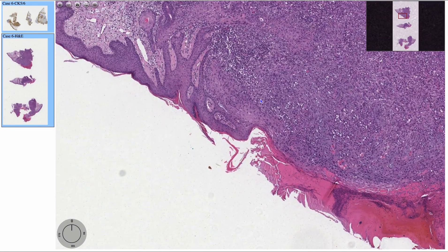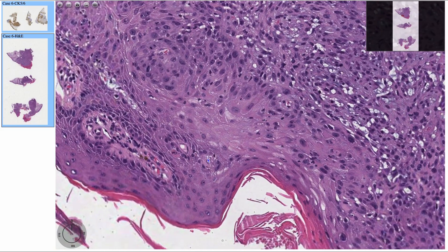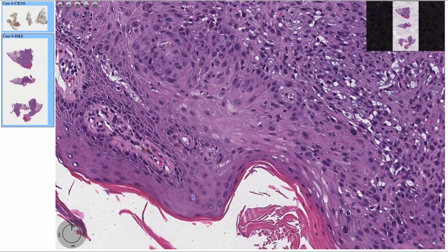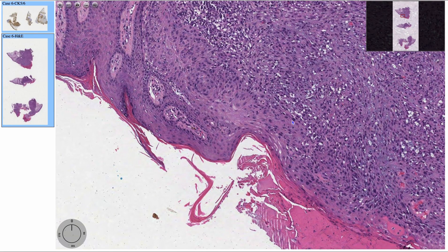And we see this epidermal proliferation with ulceration that extends to the dermis and subcutis. You can see here the epidermis where you can appreciate the intercellular bridges, and then it kind of becomes dysplastic here. And you can see the transition and the extension to the dermis.